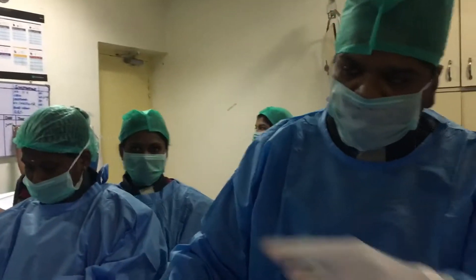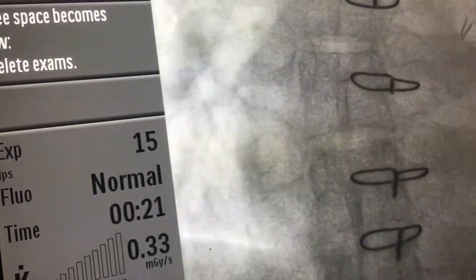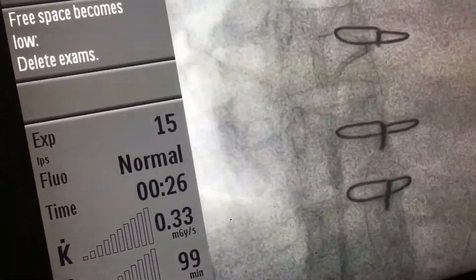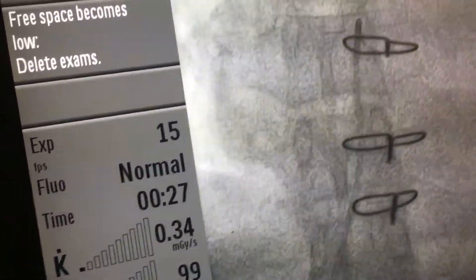So I am going to the RV. Now just show the fluro, focus on the fluro. I am just going to enter into the RV. So now I am going into the RV. I am just trying to go into the RV.